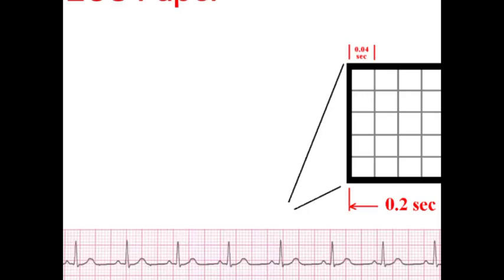This is why you can know the heart rate by just reading the ECG, because the ECG paper measures time.